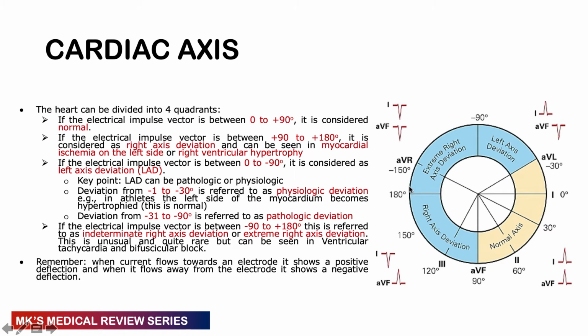Then you may have, in some extreme cases, where the axis is now falling on the opposite side. So between minus 90 and 180 degrees.